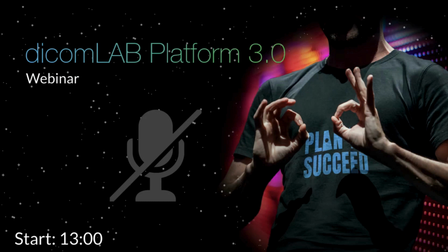So in this video, I'm going to talk about our latest release, our latest software update, which is kind of a big deal at dicomLAB because we are super proud to announce that we are going to show you the world's first completely web-based treatment planning software, which is not only a viewer, but also a planning software as a whole.